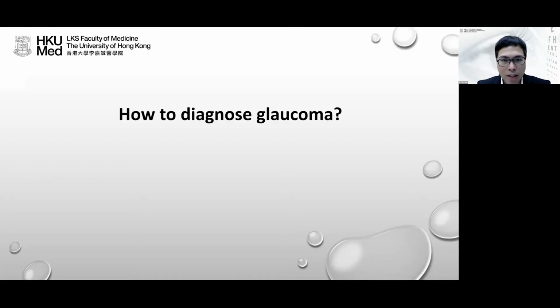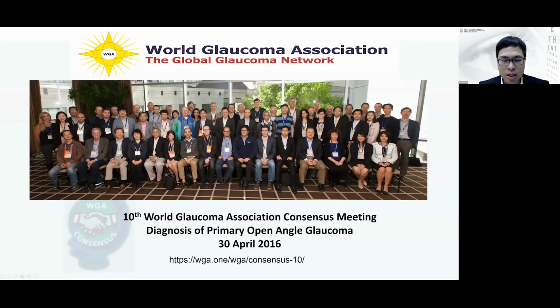Okay. So one important question we need to ask ourselves when we decide what parameter to measure in the diagnostic evaluation of glaucoma is about how to establish a diagnosis of glaucoma. Back in 2016, we had a group of glaucoma specialists from different parts of the world to come together to discuss about how to diagnose glaucoma. It is the World Glaucoma Association Consensus Meeting.